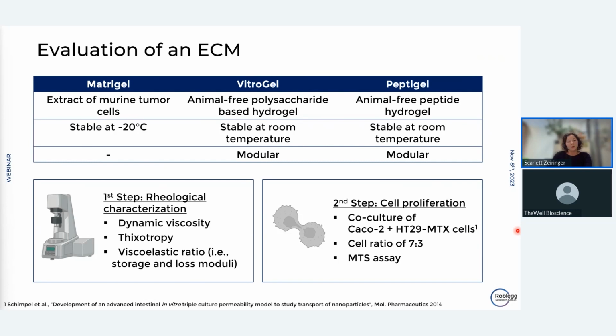In addition to these animal-based systems, there are also synthetic hydrogels, namely VitroGel or Peptigel. VitroGel, for example, is a polysaccharide-based hydrogel, and Peptigel is a peptide hydrogel.